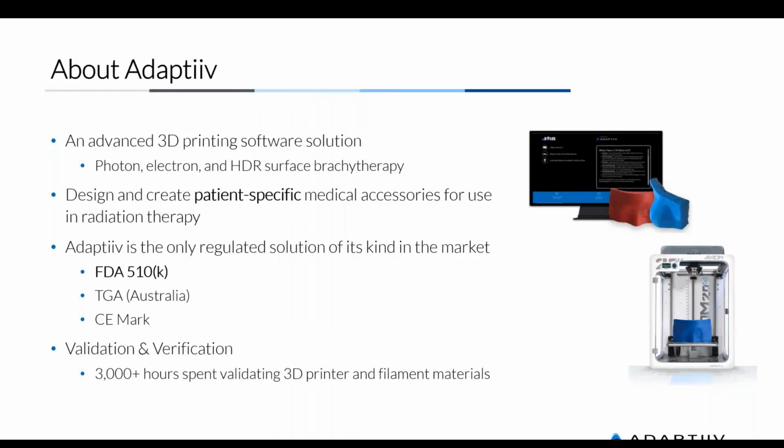The biggest advantage, and the thing that we are most proud about, is our offering of personalized medicine in healthcare today. Our software uses patient-specific data from a CT scan to create medical accessories for use in radiation therapy.